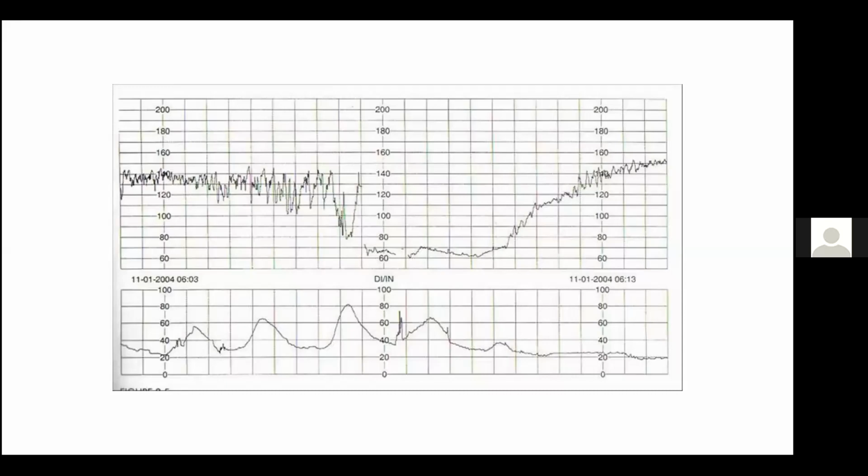What has caused this? So this is actually very common when the mother is lying supine, and then they get this supine hypotension. And if you check this mother's blood pressures, so if you see this, your response as a clinician, remember we're learning about response here, should be immediately to turn the mother to the left lateral position. You can actually measure her blood pressures. And if you find her blood pressures are 80/40, then you will know that this was postural, and then you can run a drip to infuse some fluid to really improve this hypotensive episode.